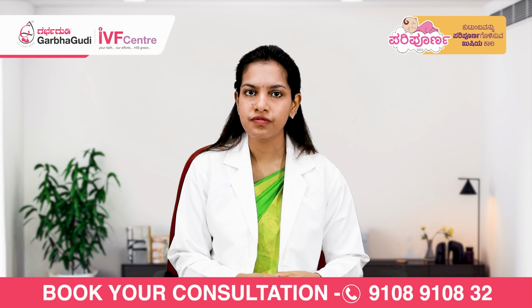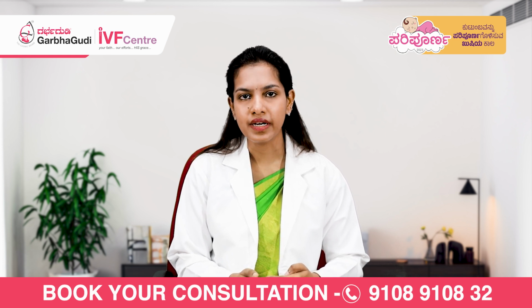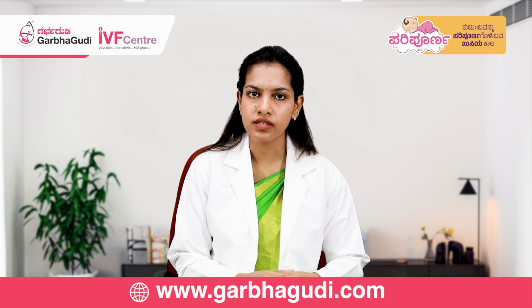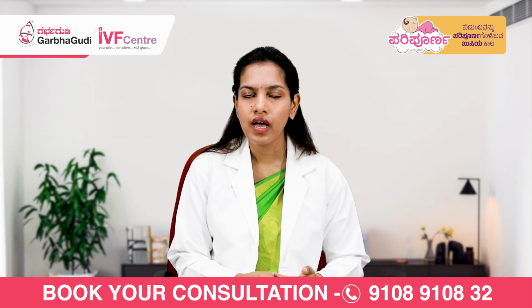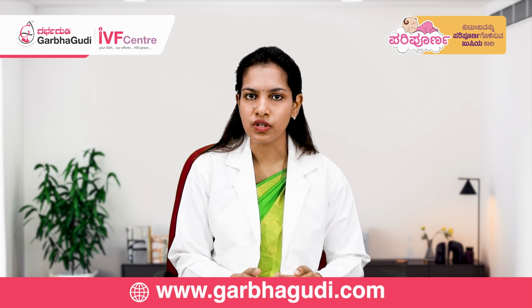Also, when we come across females with persistently thin endometrium, despite all medications that we may be giving them, this procedure is suggested. It may also be combined with something called a subendometrial PRP injection, which has shown promise in increasing both the vascularity and the endometrial thickness. So these are some of the indications where we do hysteroscopy.